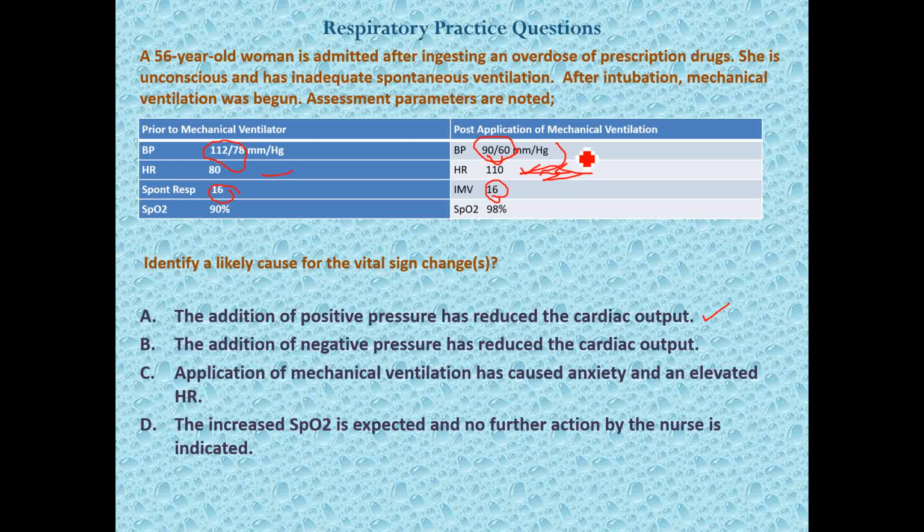The heart rate goes up, and even though the blood pressure went down slightly, but still kind of in the normalish range, it is that elevation in heart rate that we see. Now, a lot of individuals, seasoned nurses, may think, well, that heart rate's going to go up because you're shoving air in this individual's chest, and so it's not the most comfortable feeling in the world. And so this, of course, can cause anxiety for the patient, but that is not what's going on.